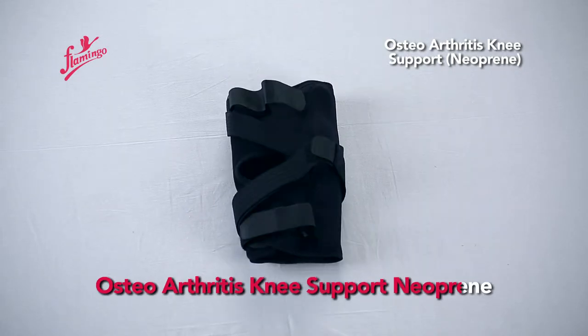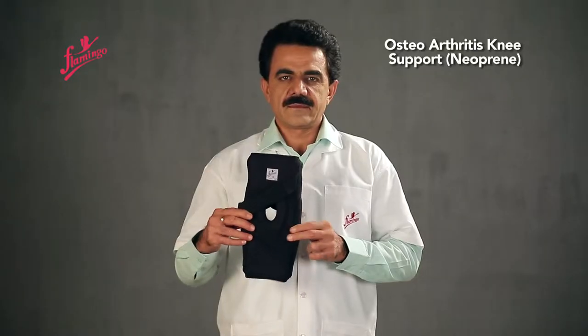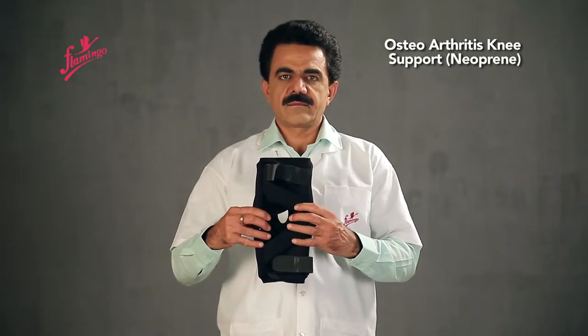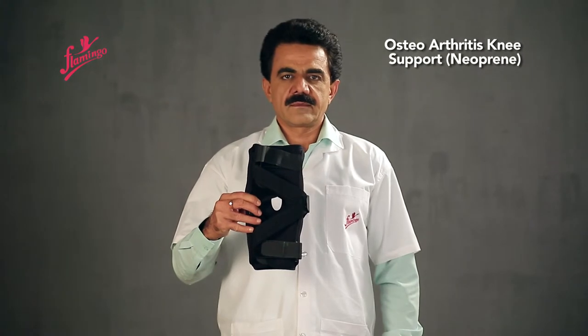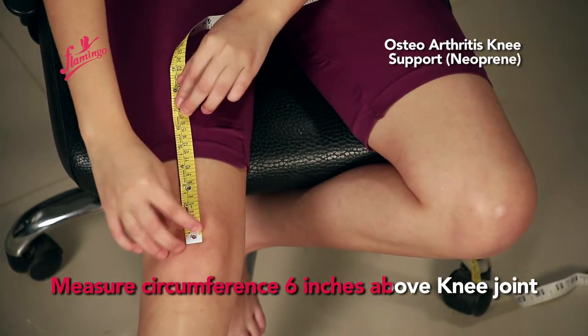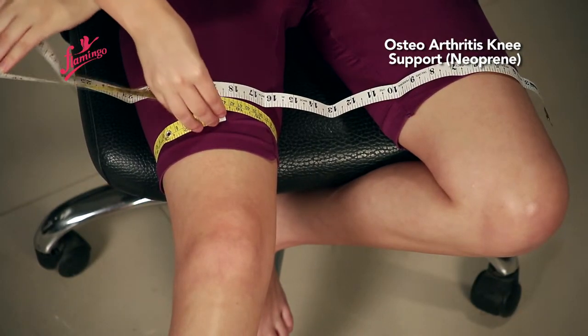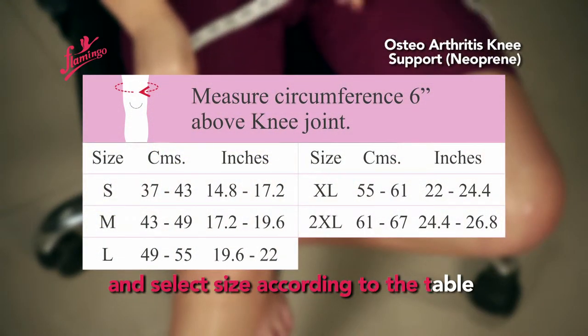Osteoarthritis Knee Support Neoprene. Measure the major circumference 6 inches above the knee joint and select the appropriate size according to the sizing table.